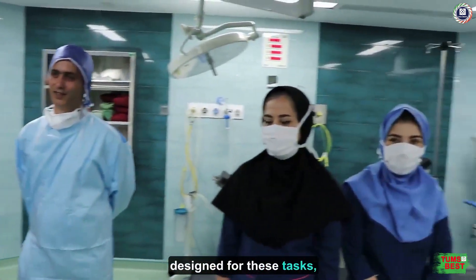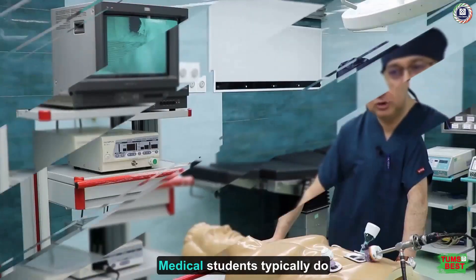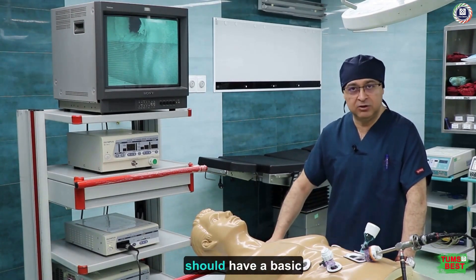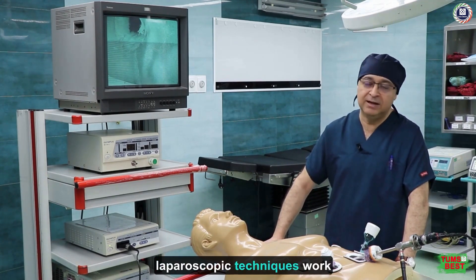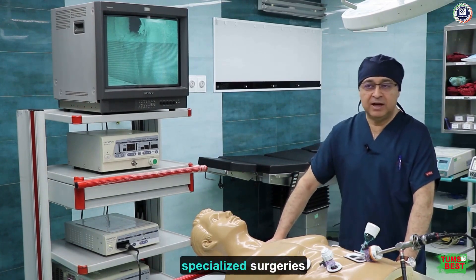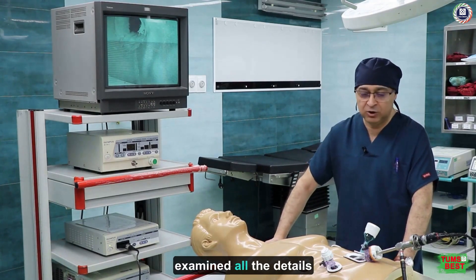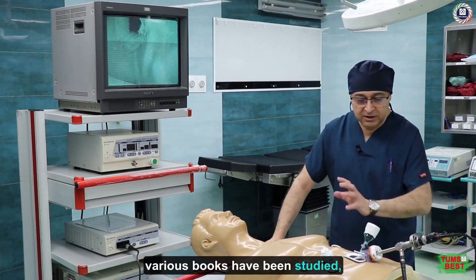We can also use pre-made devices designed for these tasks, allowing us to place anything inside this mannequin for educational use. Medical students typically do not perform laparoscopic procedures — it usually starts with residents. Specialists, particularly operating room specialists, should have a basic understanding of laparoscopic movements. Surgeons who practice laparoscopic techniques work in various fields including obstetrics, general surgery, specialized surgeries, and urology. The value of this simulator lies in the fact that it has been designed within the university system, with all design details thoroughly examined.